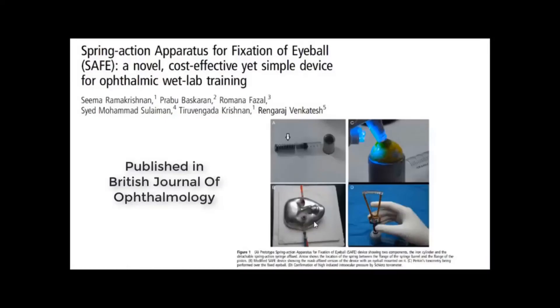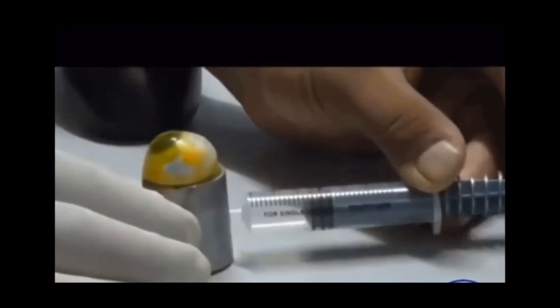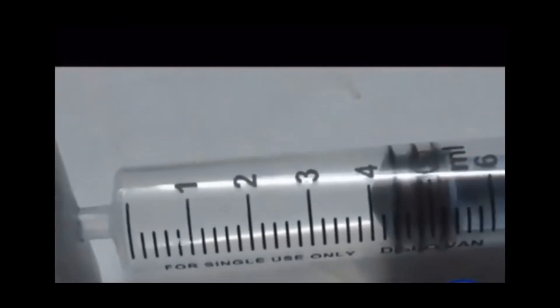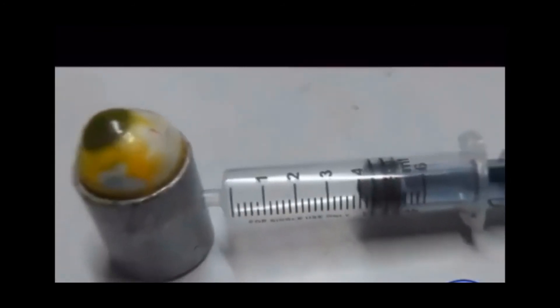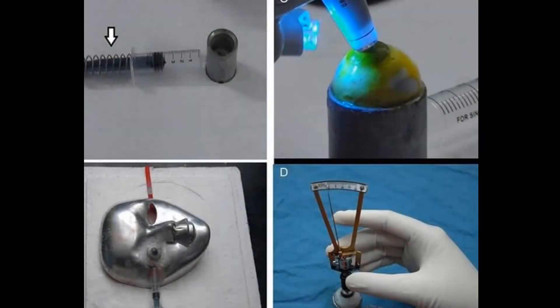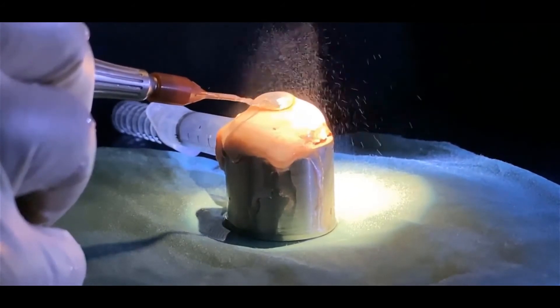Safe Spring action apparatus for fixation of eyeball is a robust, simple, and economical device to solve the problem of achieving a formed and firm eyeball which is stably fixed in a holding device in surgical wet lab training. The spring action syringe generates vacuum and enables reliable fixation of human and animal cadaveric eye on the iron cylinder. The rise in intraocular pressure due to vacuum fixation can be varied as per need or nature of surgery.